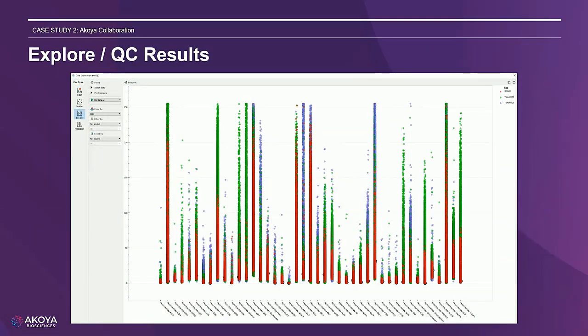Using the Explore QC module, we can import object data generated in the workflow and begin to assess stain quality and variation per image, per ROI, and per marker. We can use the tools available to gain a better understanding of any interesting dynamics occurring. Outliers can be identified in particular marker channels, ROI, or images analysed to give a heads up on any potential variation observed.